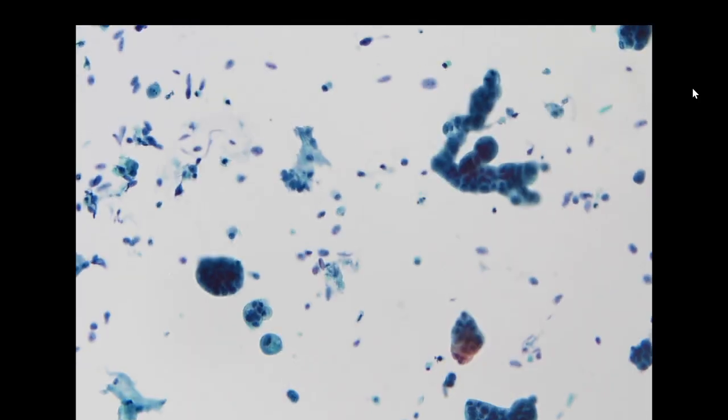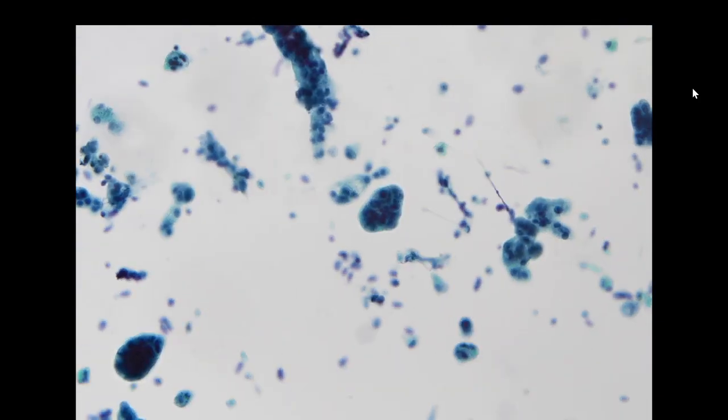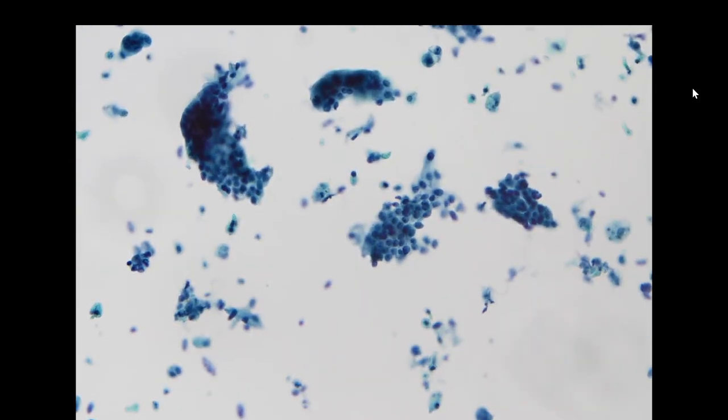And the third one, because she is a female, we just want to confirm whether it could also be coming from the breast, because sometimes breast cancer can go through the axillary drainage and to the subclavicular region. So we do GATA3. I ordered three different stains for this case, and we will use the cytospin preparation because it's more likely that we will still have cells in the cytospin.